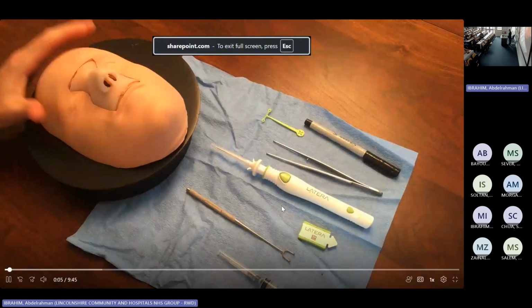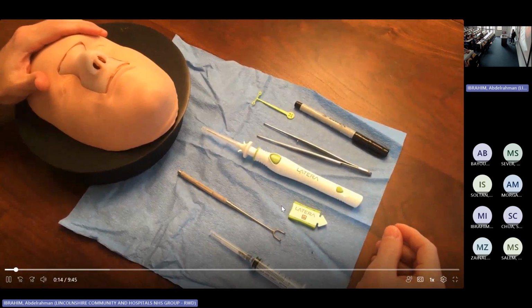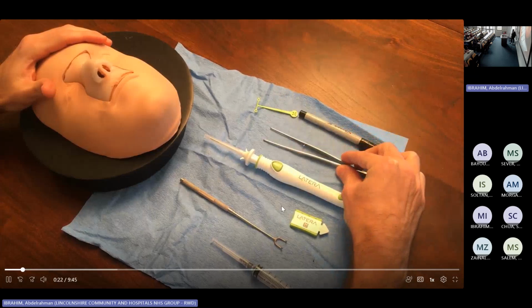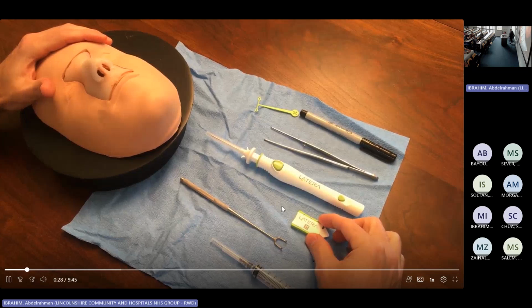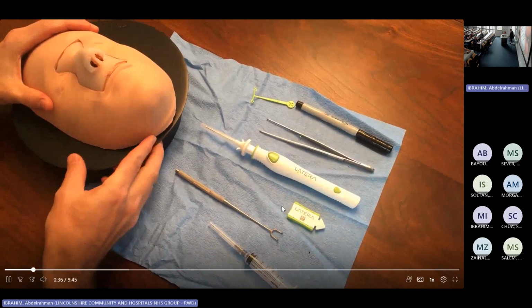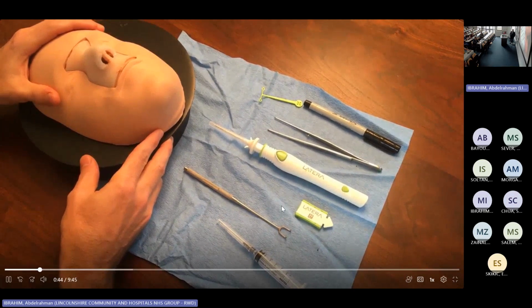So I have my patient here, Mr. Smith, and Dr. has prepped the Mayo stand with everything that we need: a marking pen, the Latera positioning guide, a forceps with smooth tips, the Latera delivery device, the Latera implant tray that contains the 2 implants, a double prong skin hook with sharp prongs, and an injection needle. First of all, Latera is done mostly concomitantly with septoturbs, and Latera will always be the last procedure done, after all the packing and so forth.